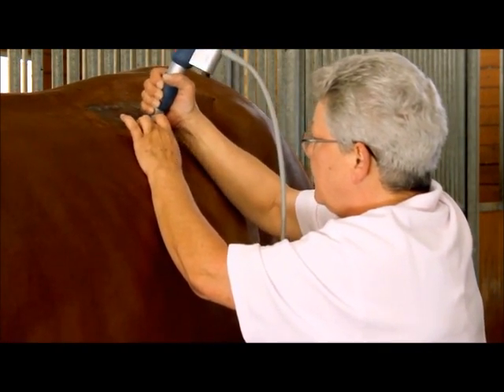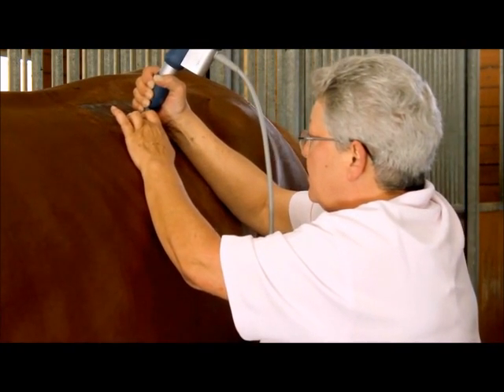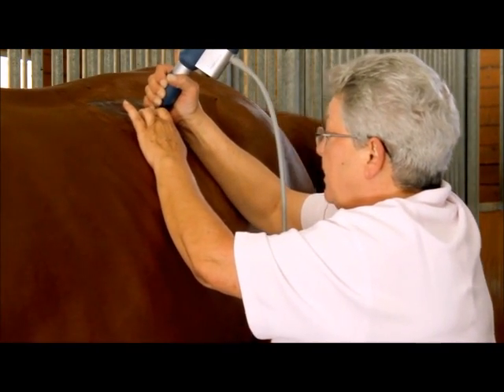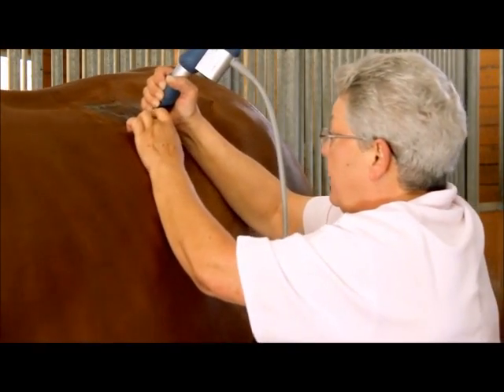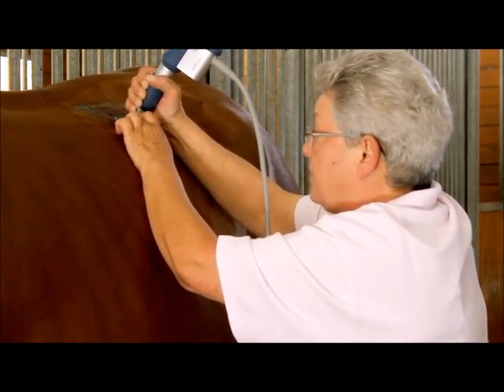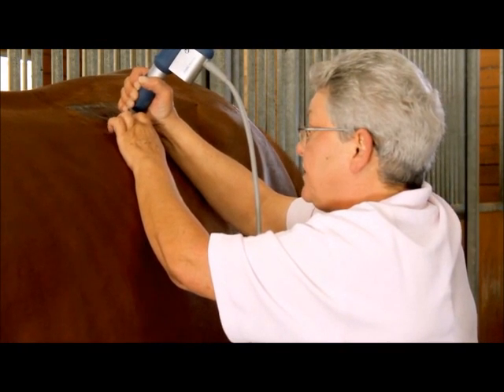We use different transmitters for the therapeutic vet, depending on how deep I want to go in. I have a transmitter that goes in about 2cm to 6cm.